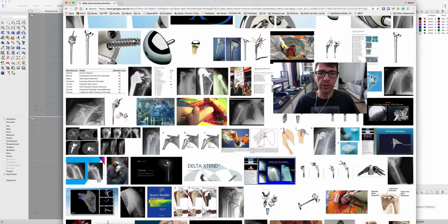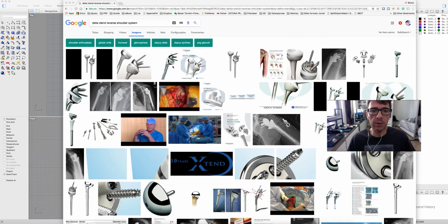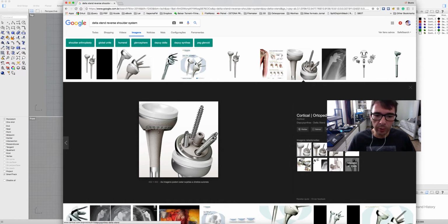First of all, let's show here our delta reverse total shoulder. What is a reverse total shoulder? Here we can see the humeral side and the glenoid side. Here we can see this picture, and here we can see in a better way. So here this is what we're going to draw. This is what we're going to design.